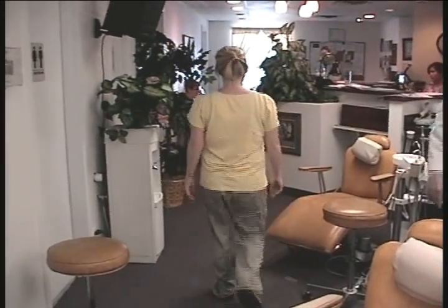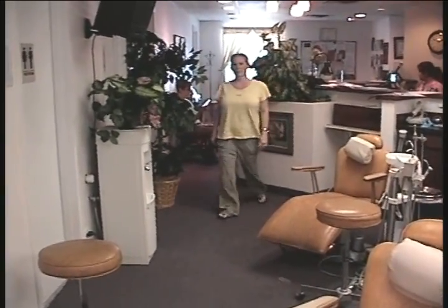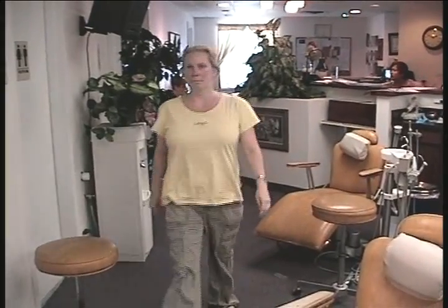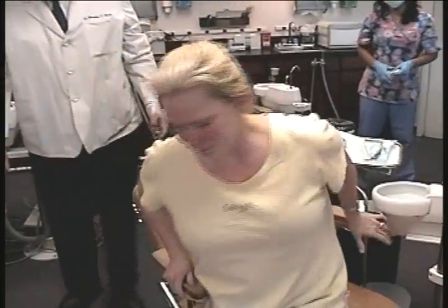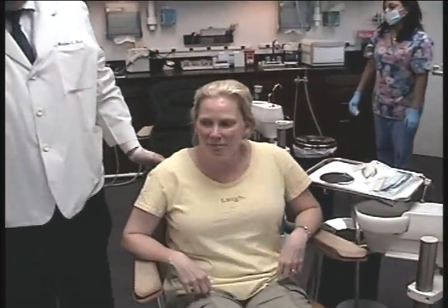Okay, do it one more time up to that. What's the difference likely to be when she's off medication? Even better. Can you believe it, much better? Okay, we are rebalancing the patient's surgical splint to compensate for any muscle spasm, swelling, etc. And then we'll dismiss the patient and see her in the near future.